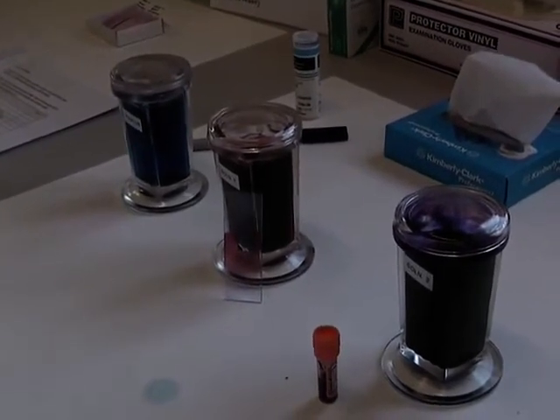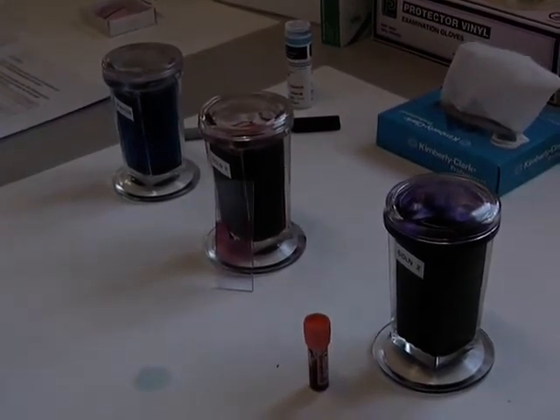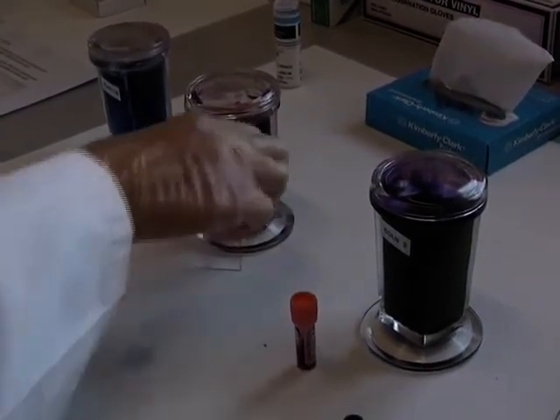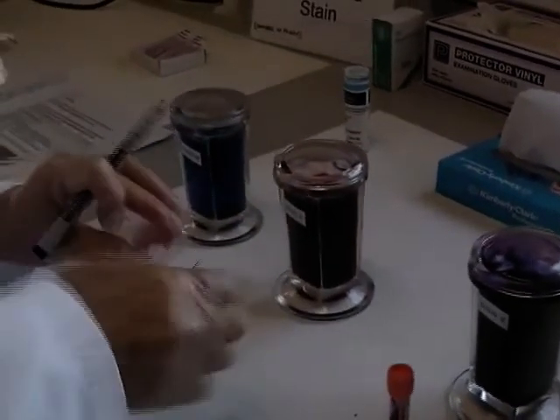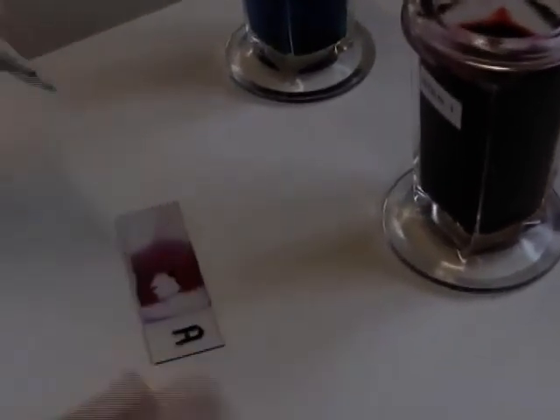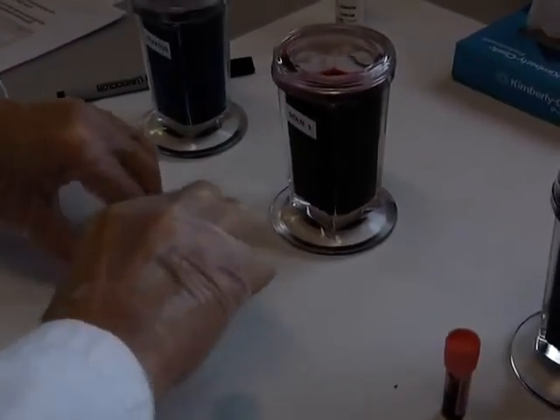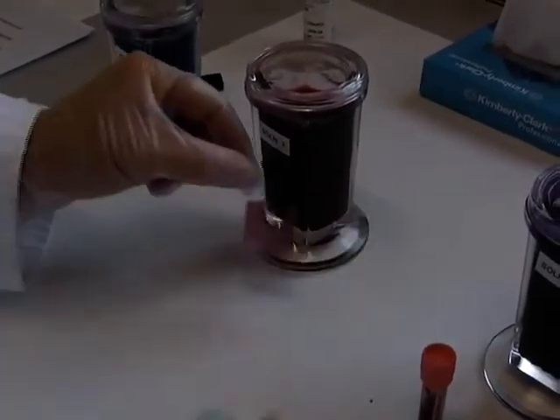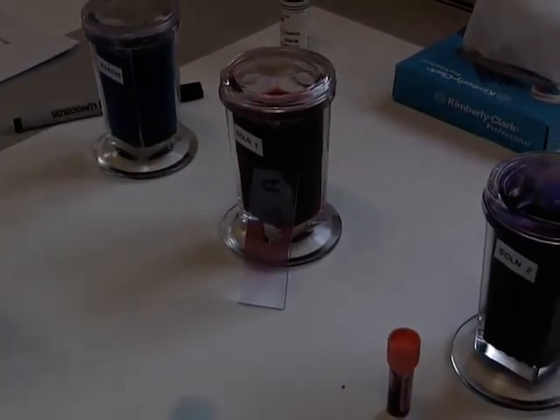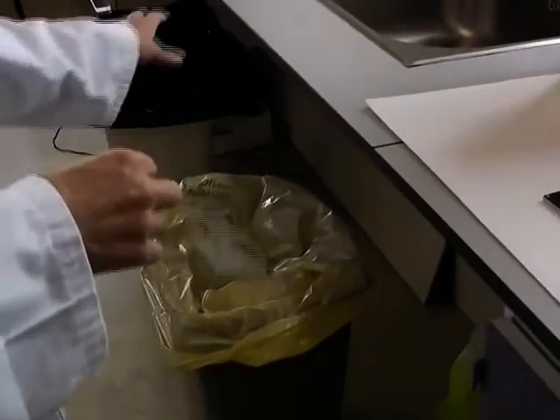When your slide is dry, identify it by whatever is your accepted means — date, sample, etc. Dispose of your gloves appropriately, and now it will be ready for assessing under the microscope.